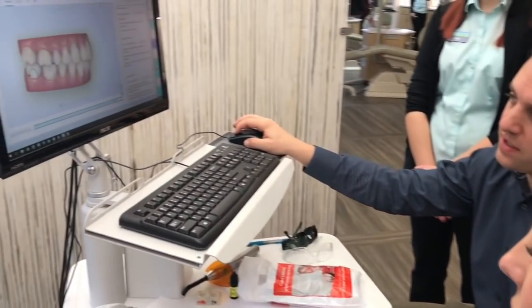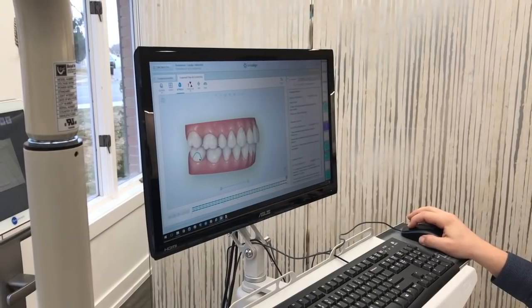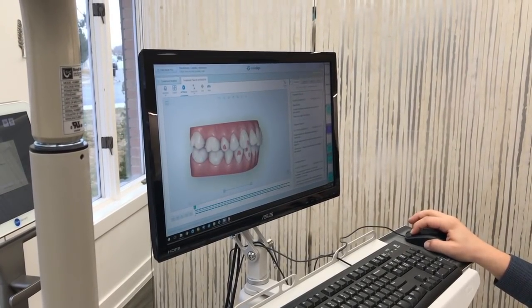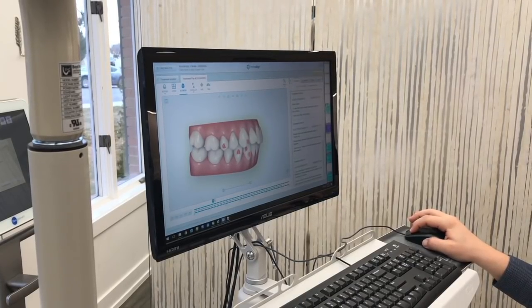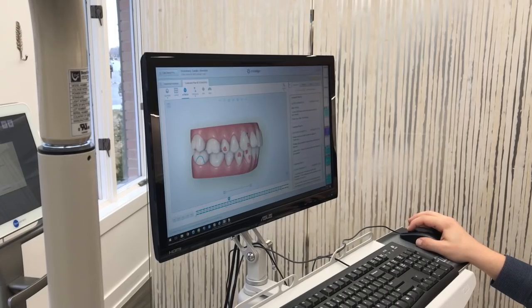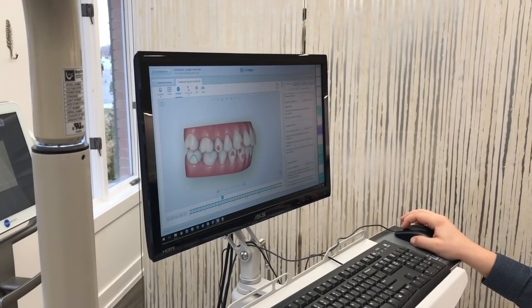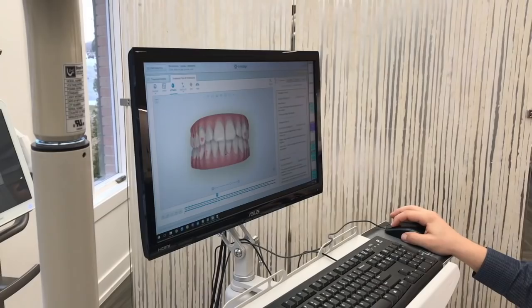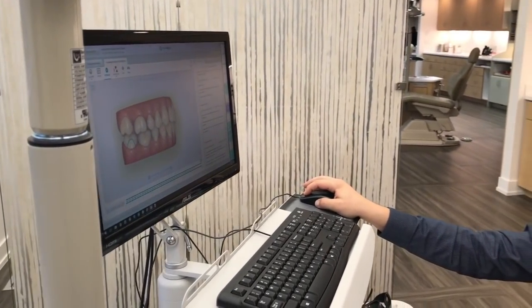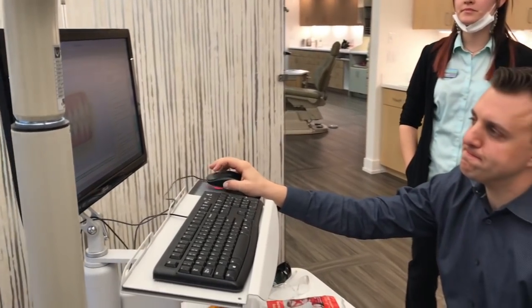These little blue marks are going to be the cutouts for your elastics. So those aren't going to be filled right now, but when you come in next time, the next ten aligners we give you are going to have these little cutouts, so they'll go a little bit different. And that's when we can start the elastics if we want to, and that's what takes care of that front-to-back correction.